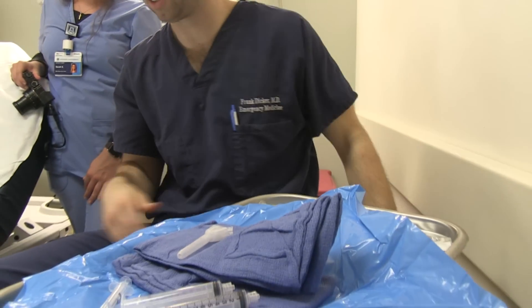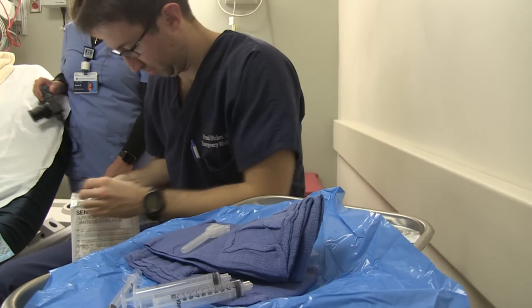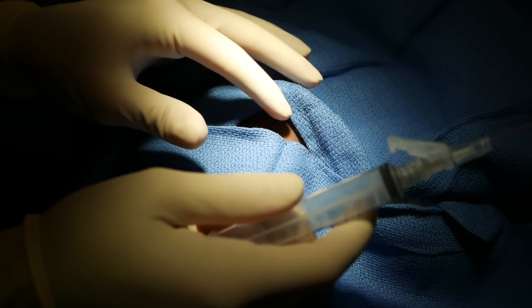There's not going to be a huge amount of fluid come out of that joint. If we get one cc I'm going to be happy with that. What size needle do you have? Twenty-two. Good.